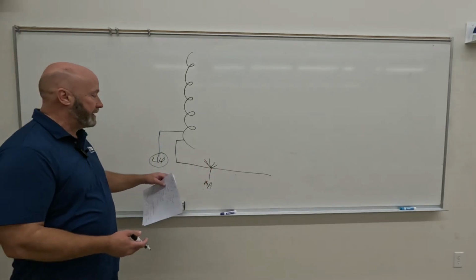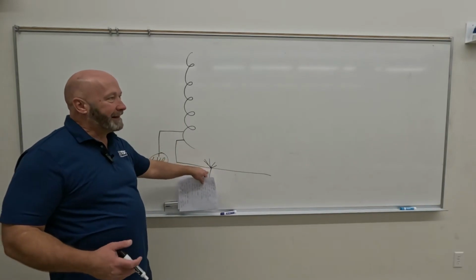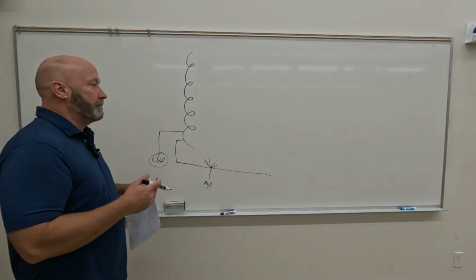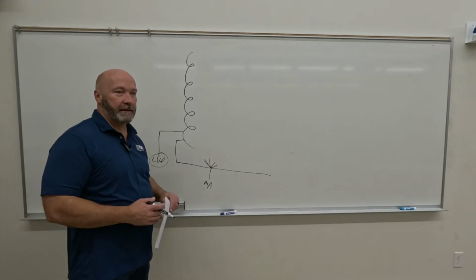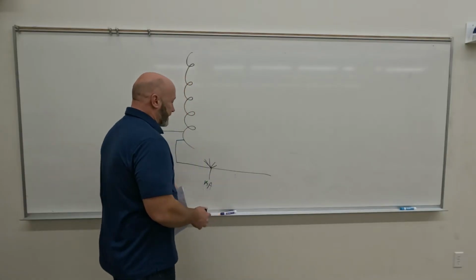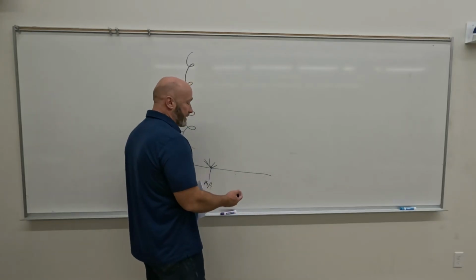It's just specific levels as opposed to kVp. Both of them are considered a rheostat because you can turn up and turn down. It's just that these are more discrete, or individual, settings, like 50, 100, 200 and things like that, as opposed to kVp, which is pretty continuous. You can select any kVp level. So the mA selector is also a rheostat. It controls the current through the filament, not through the tube itself, until we make an exposure.